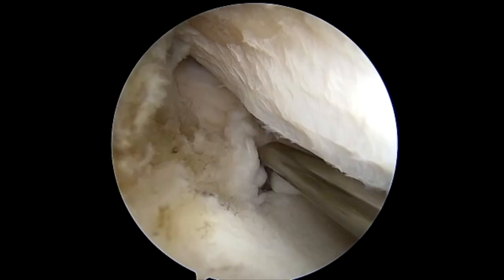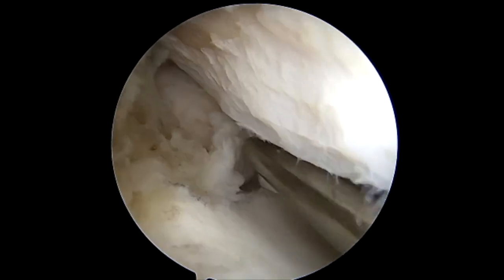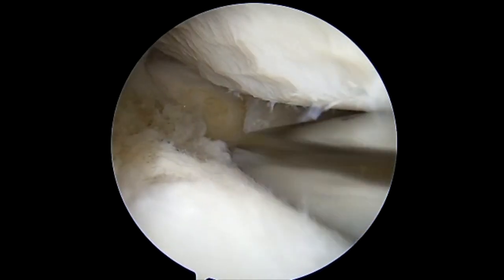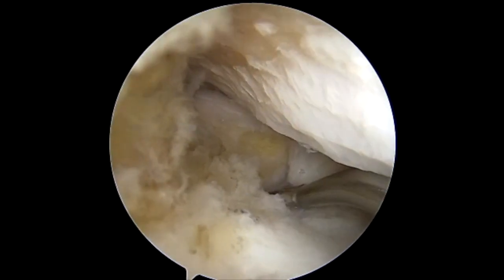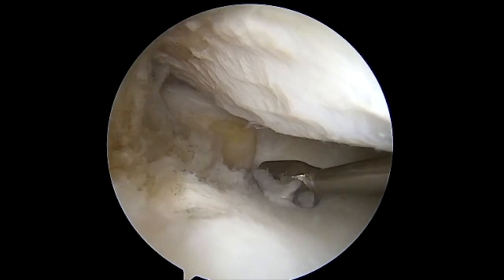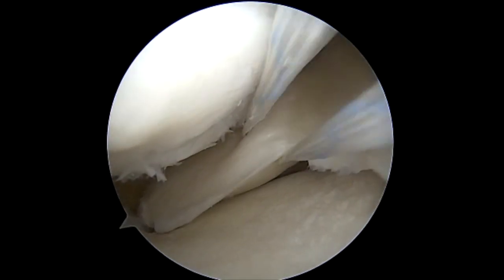As you can see here, this is a one-year-old meniscal root tear. It was chronic in nature. We used a ball rasp to clean up the meniscal root. The remainder of the meniscus was untouched and in good quality. There were some minor changes to the medial femoral condyle. We used a curette to clean the area to improve healing.